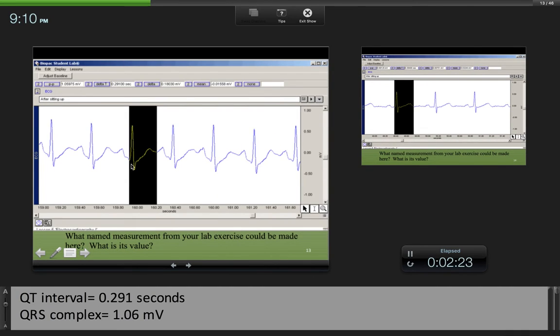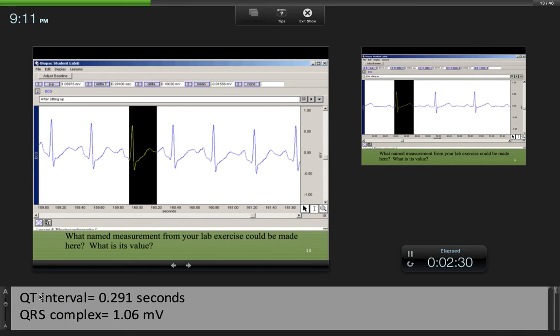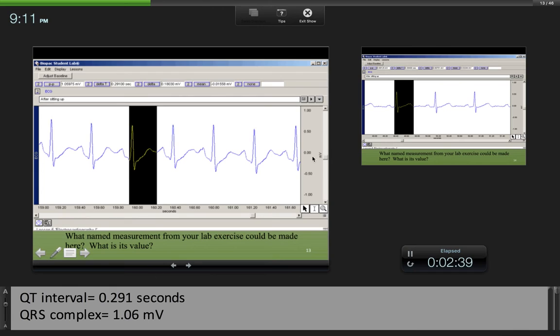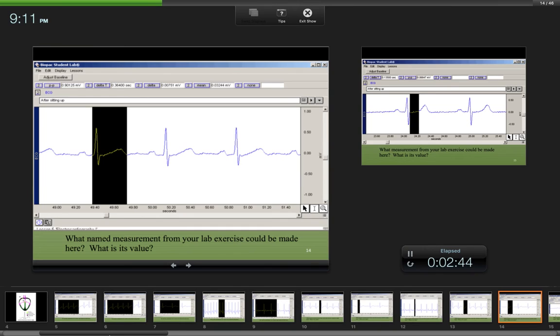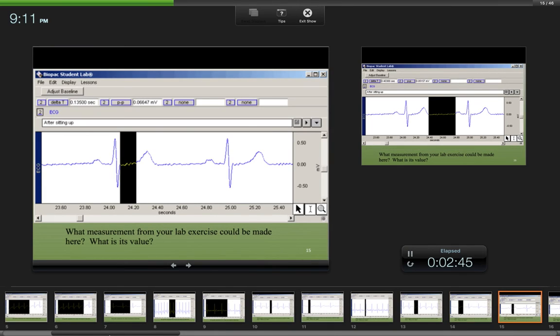Here we have a QRS complex, the ST segment, and a T wave. We're going to call this the QT interval. We can also measure the peak to peak here and get the QRS complex amplitude. That's going to be in millivolts, and that is on this axis. We have the same example here, delta T and peak to peak.